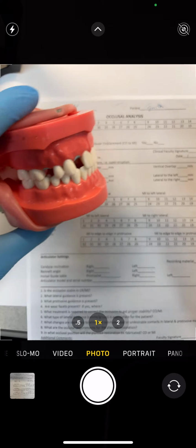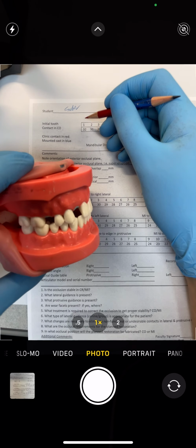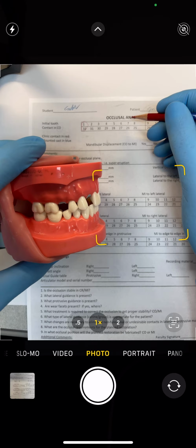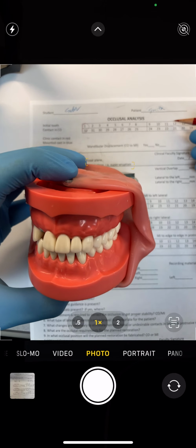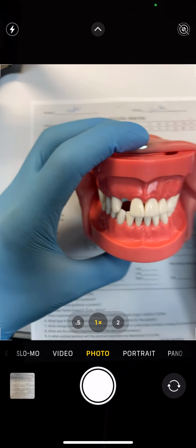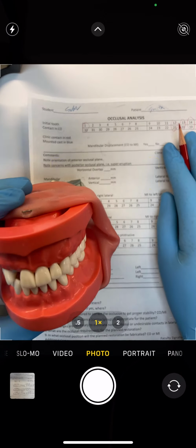So in red I'm going to mark 1 was catching heavy. As well on the other side I found number 12 was holding shim stock, 13 and 14. So I write those in the clinic.